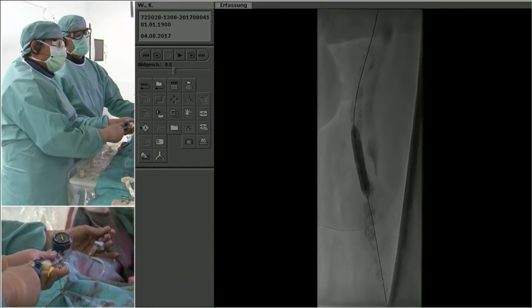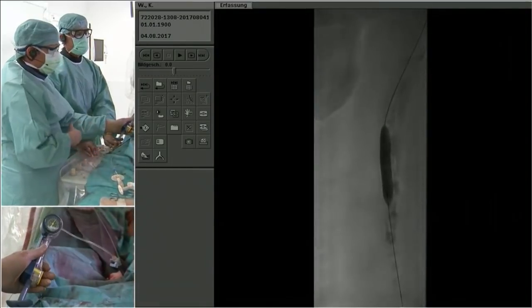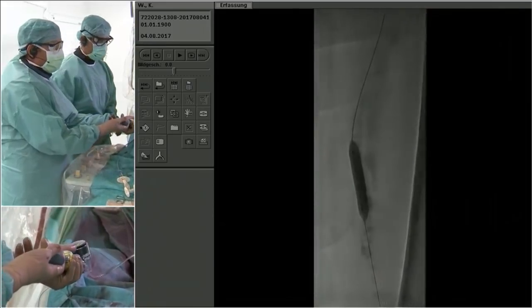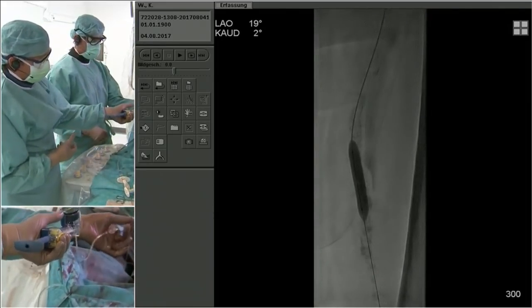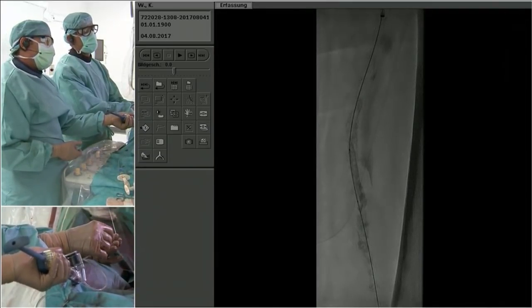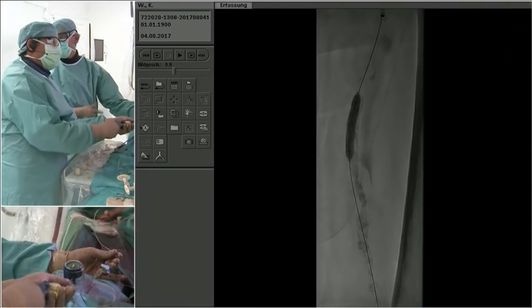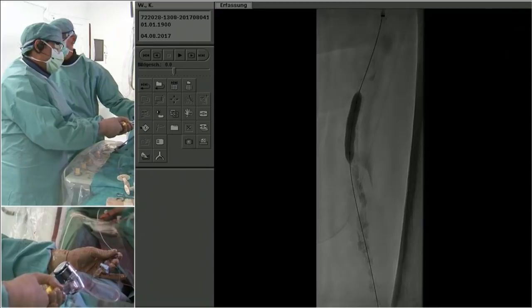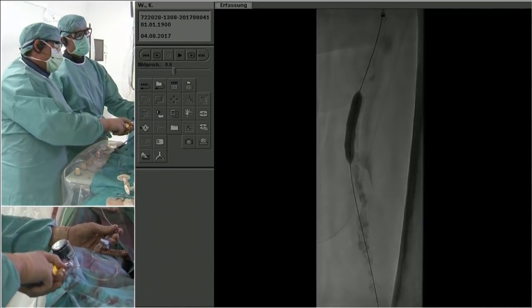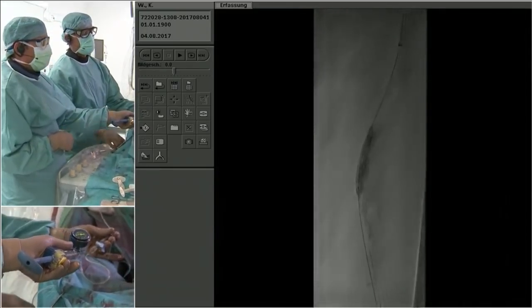Regarding DCB, I think the calcification may limit the penetration of the drug, and I'm not quite sure I would go with that. I think Andrea's group has already published use of DES in long lesions. So how many on the panel will actually consider implanting a Zilver PTX or a DES stent here? Anyone? You can raise your hands or say your comments here. Ian, I want to invite you to this. There is data on the Japanese post-market on highly calcified lesions and how they behave in this environment, and they seem to be positive data. So it is certainly a consideration.